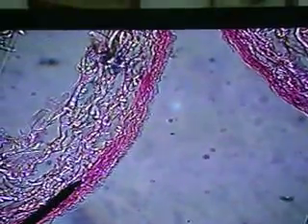So there is a tunica intima with an endothelium. There is a tunica media, and there is an adventitia. However, the tunica media is very thin, very reduced, a very small tunica media. And we see an absence of the internal and external elastic membranes. Now when I'm dissecting the body, what I notice about the inferior vena cava is that the adventitia, believe it or not, is considerable.